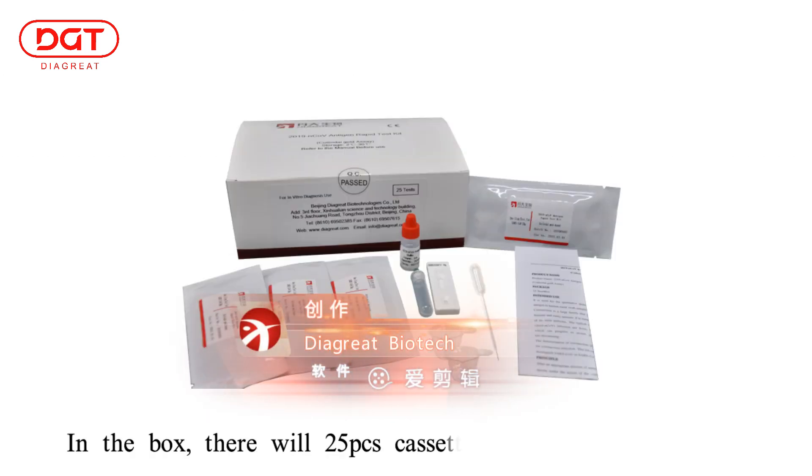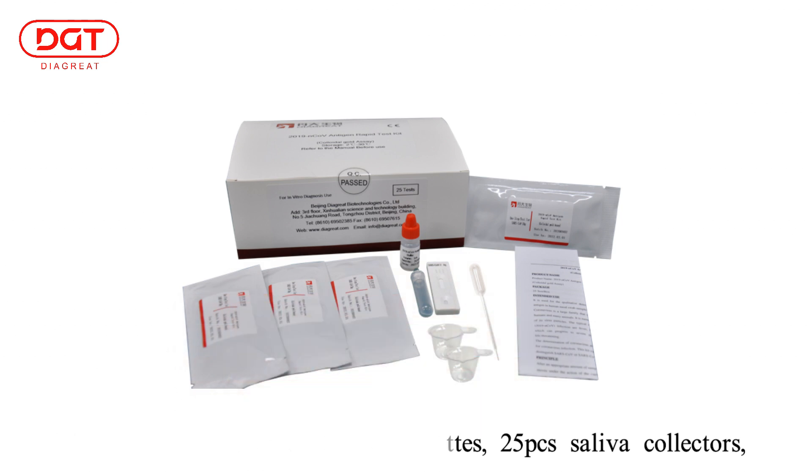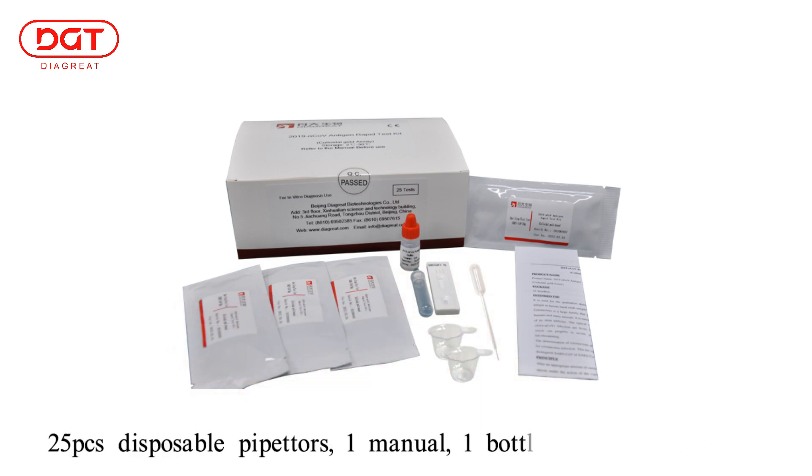In the box, there will be 25 cassettes, 25 saliva collectors, 25 disposable pipetters, 1 manual, 1 bottle buffer, and 1 tube rack.